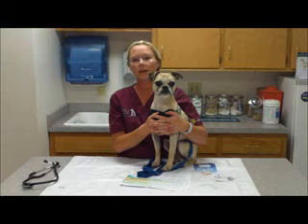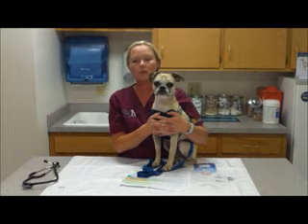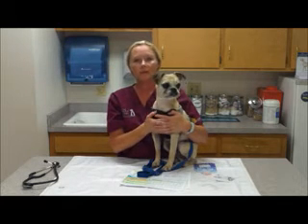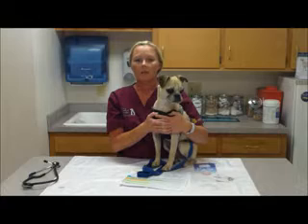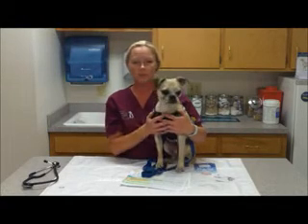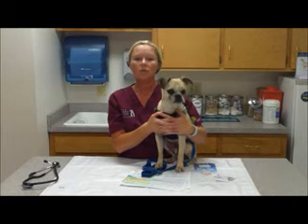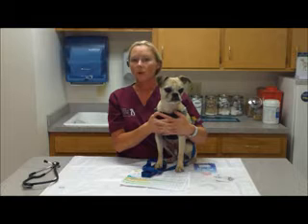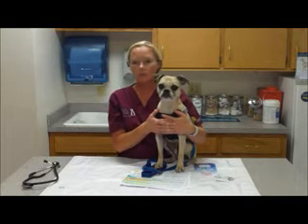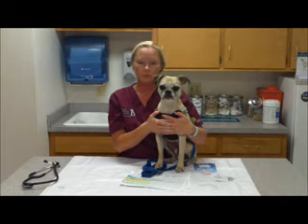Normal temperature for an anesthetized patient is 97 degrees to 100 degrees. That needs to be checked every 15 to 20 minutes. Usually we check it every 5 when we're checking everything else, just to keep it all on the same track. The greatest loss of temperature happens within the first 20 minutes. Hypothermia, if their temperature is too low, has a prolonged recovery period, and if it gets super low, you can have CNS depression as well.